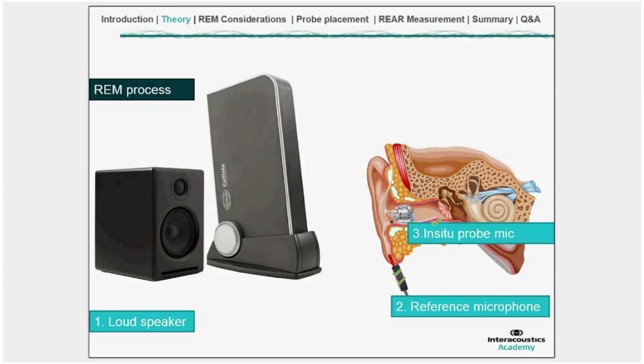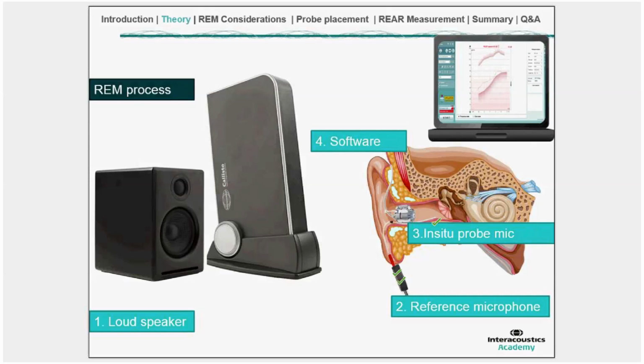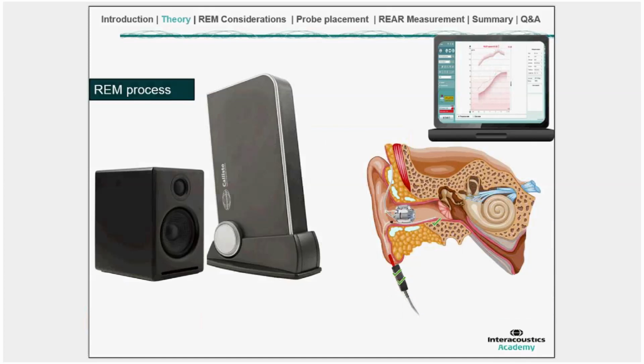What we then need to have, of course, is some software which we're going to interpret the results against. And what we're going to do is measure what the hearing aid is doing inside the ear and then be able to display that on screen.